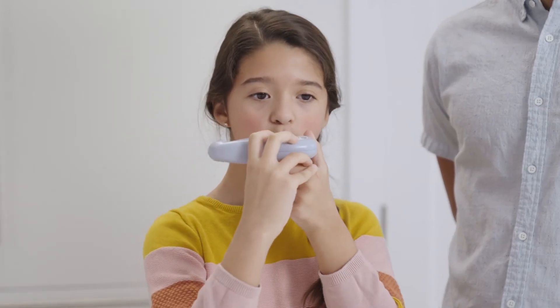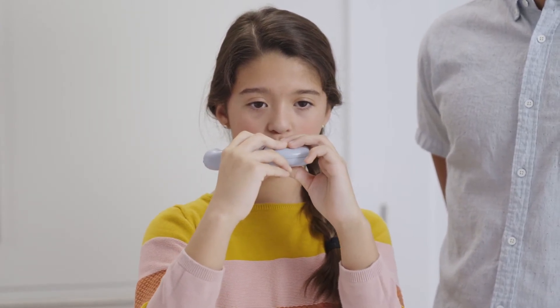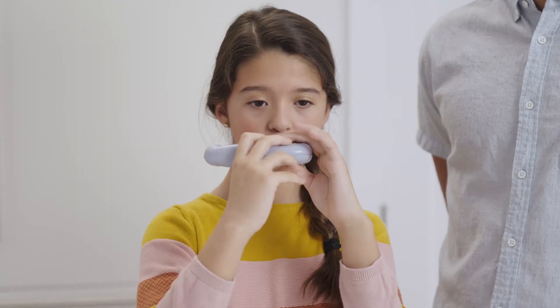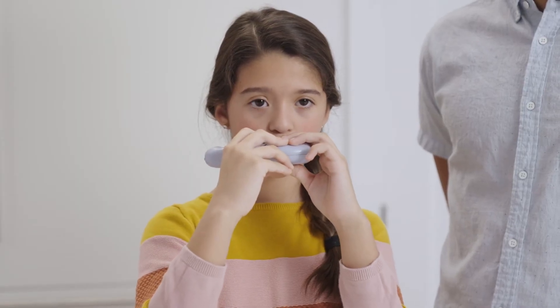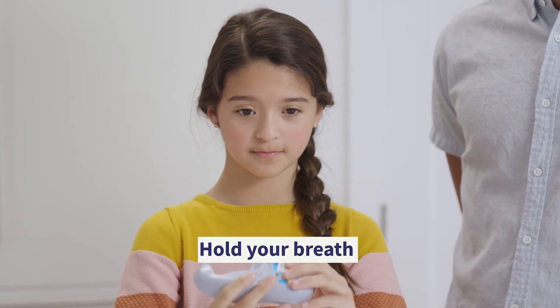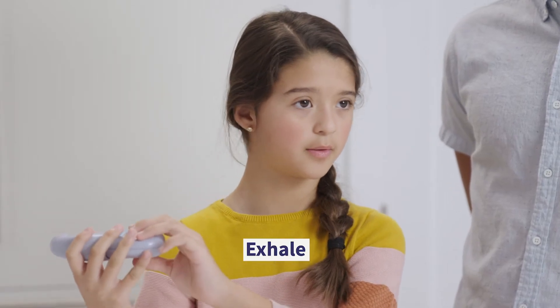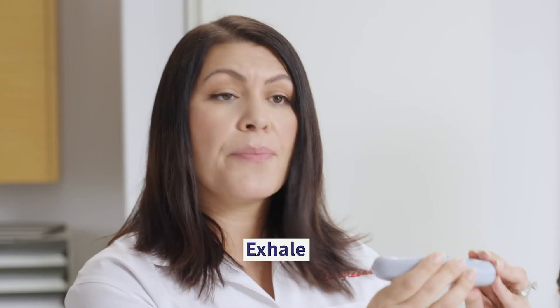Now place the mouthpiece between your lips and seal your lips tightly around it. Then hold the Discus horizontally and breathe in through your mouth rapidly, steadily, and deeply. Don't breathe in through your nose. Take the Discus out of your mouth and hold your breath for about 10 seconds, or as long as it's comfortable for you to hold it. This allows the medicine to really get into your lungs. Then exhale slowly, again pointing your face away from the Discus.